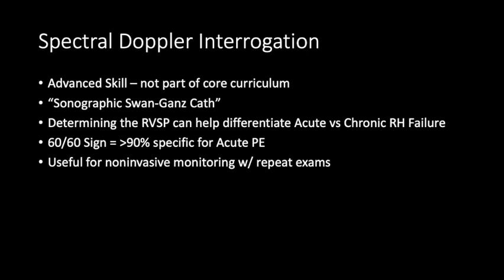Lastly, I want to introduce you to spectral Doppler interrogation of the right heart. This is an advanced skill that I don't expect you to know how to perform, how to use the machine to actually calculate all of this, because it's pretty complex. It's something that we can definitely go over if you do an ultrasound elective with me. But basically, I want you to be able to understand how to interpret these findings for your patients.